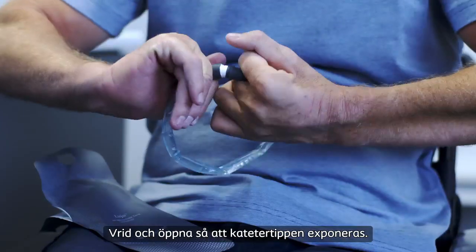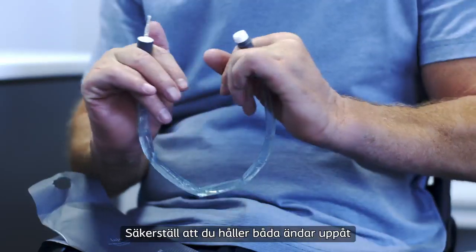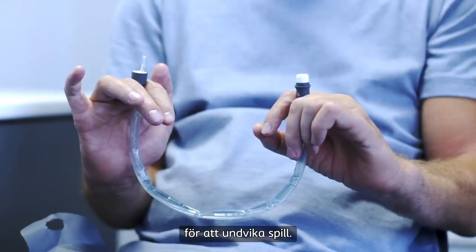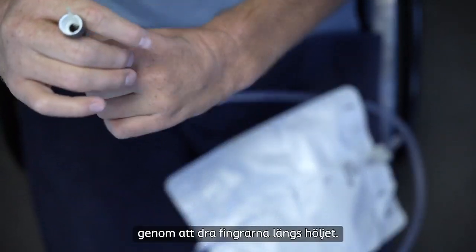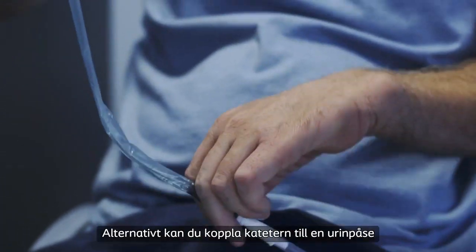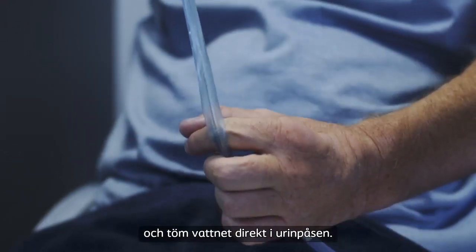Twist to open and expose the catheter tip. Make sure you hold both ends of the catheter upwards like a smiley face to avoid spilling the water inside the sleeve. Drain the water through the drainage end into the toilet or sink by gliding your fingers down the sleeve. Alternatively, you can connect the catheter to a urine bag and empty the water directly into the urine bag.